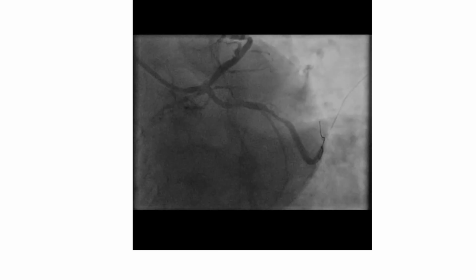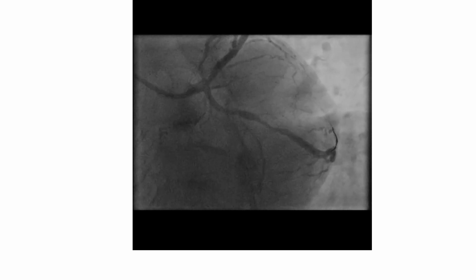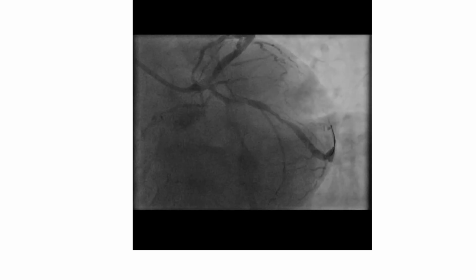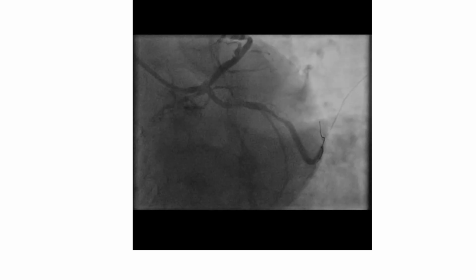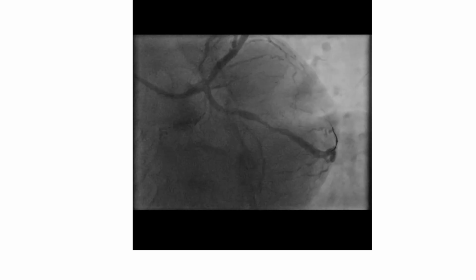This is the result after pre-dilatation. Stent could not be delivered. The angle with the left main stem is around 90 degrees, but that should not be a great problem if you have a good guide catheter support. At the second bend, there is a dissection that may also have contributed to difficulty in delivering a stent to the circ OM.